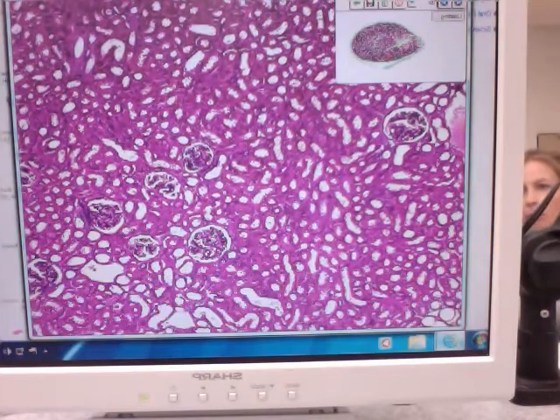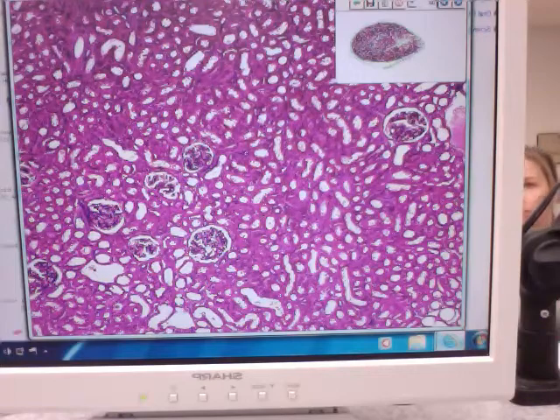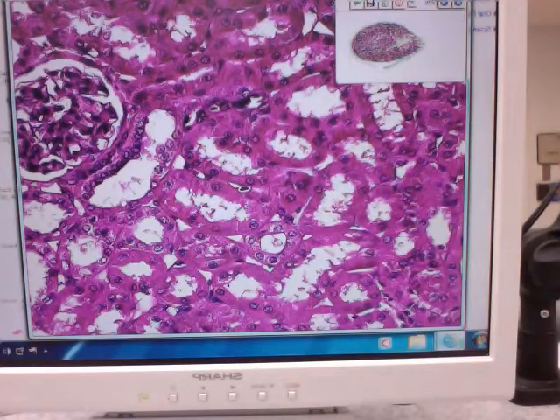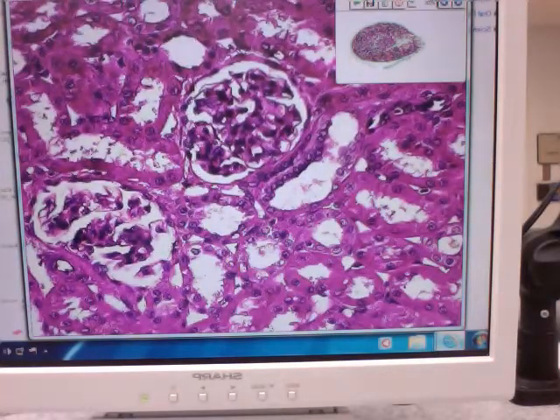Okay, so hopefully, as soon as you saw this big round structure called glomerulus, you know right away, well, I know a couple of things are going to be tested there. So you can look at it. So obviously if we come in and point to, I'm using the cross, so I point to this epithelium lining this free space. See the nuclei, flattened or squamous in shape. There's only one layer of them here. This is our example of simple squamous epithelium.